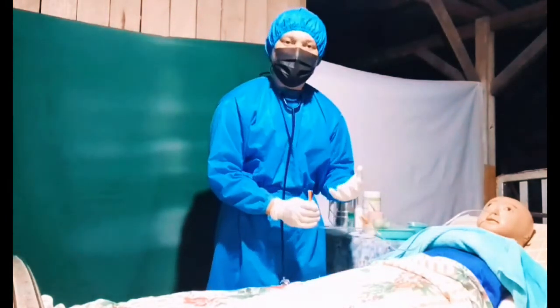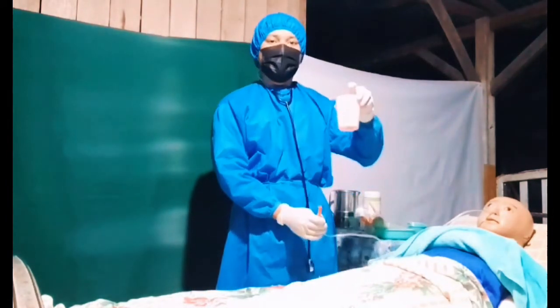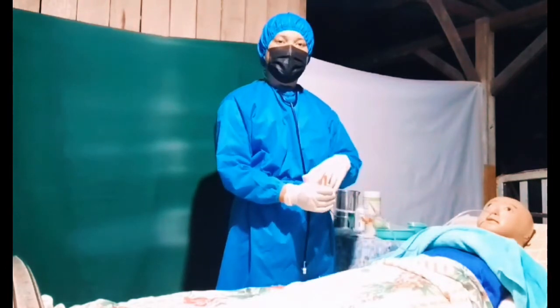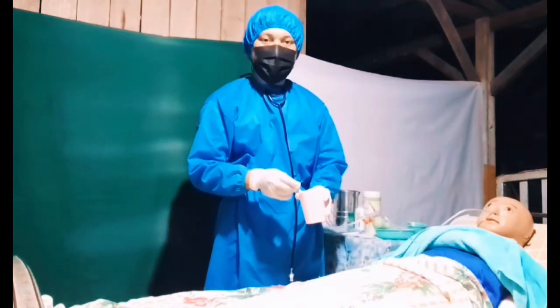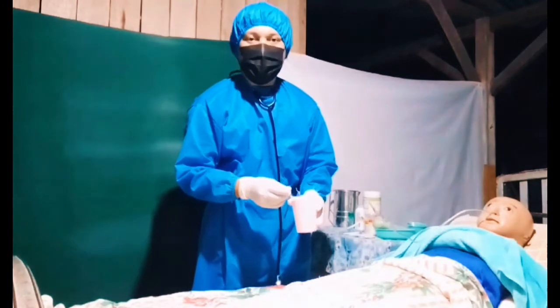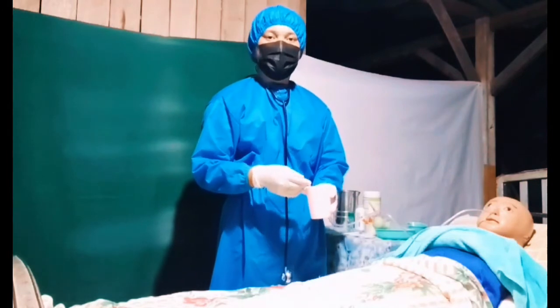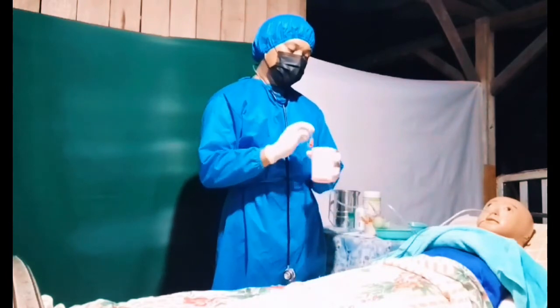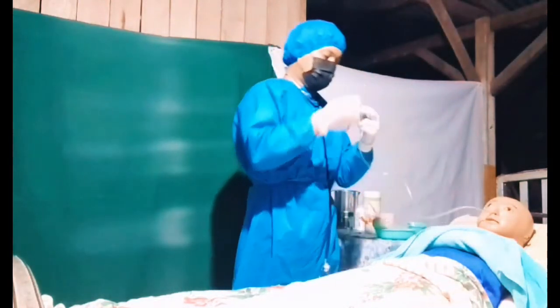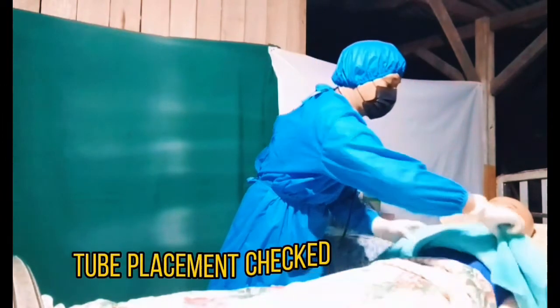Another procedure in checking the placement of the tube is to get a glass of water and submerge the tip of the tube and see if there's a bubble. If there is no bubble, that is good, but if there is a bubble, that indicates that the tube is in the lung, and notify the doctors quickly. So there is no bubble, lock the tube and put it behind the pillow.